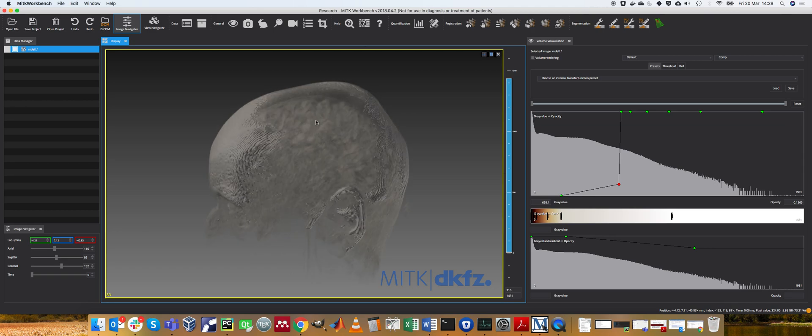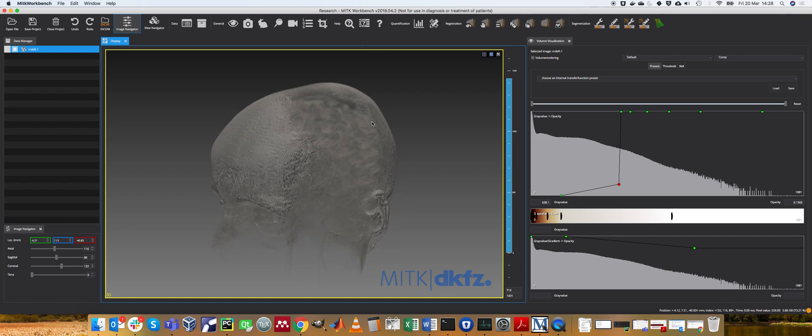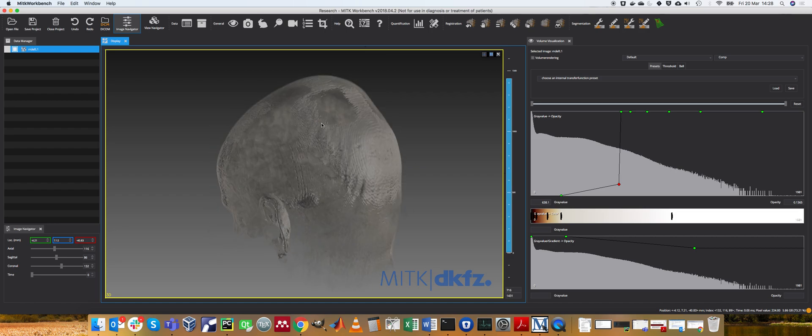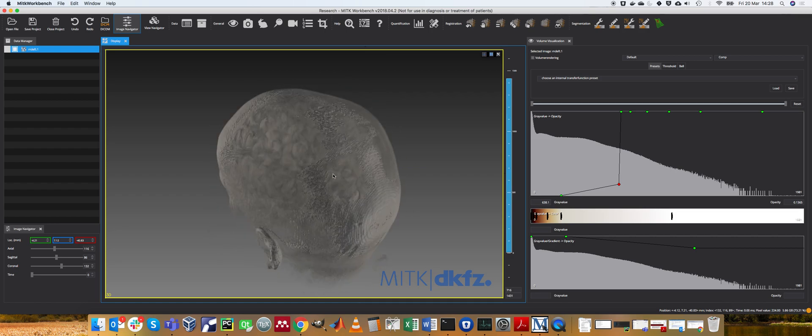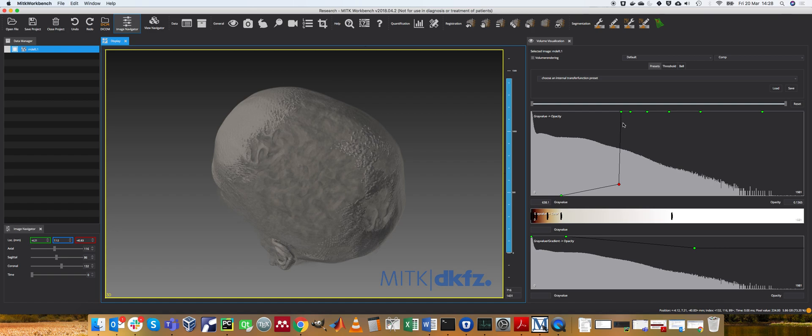So with no segmentation at all, you can start to see different parts of the anatomy purely based on mapping between intensity and opacity.